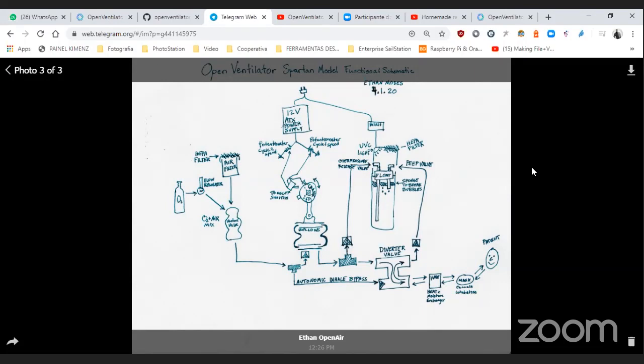So we made the entire machine with some pipe tubing and vinyl hosing. And we need to improve this machine to use sensors on a global scale, because most of the problem is to use cheap sensors, like the Arduino sensors, for something that has a critical mission control that we have to solve. That's a patient on level 4 of the crisis, for example.